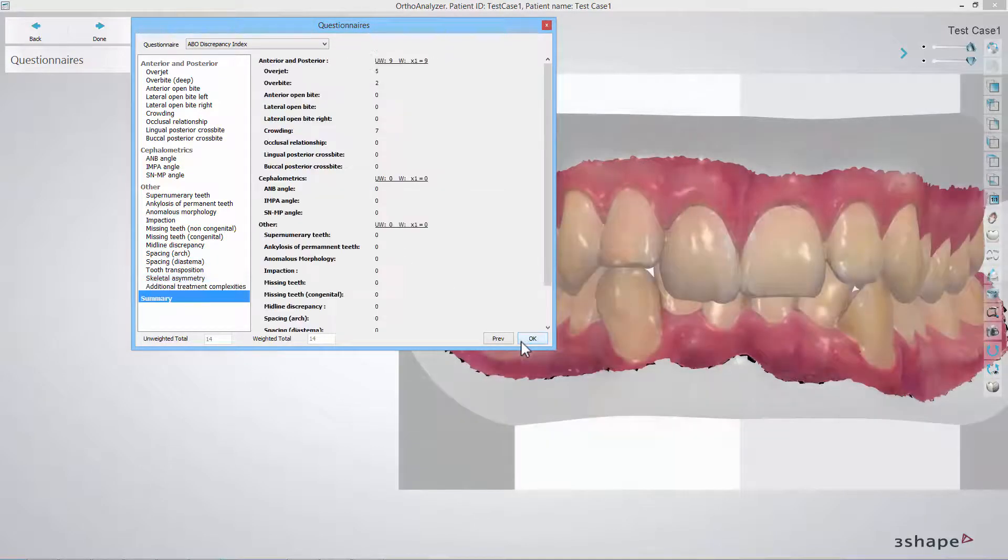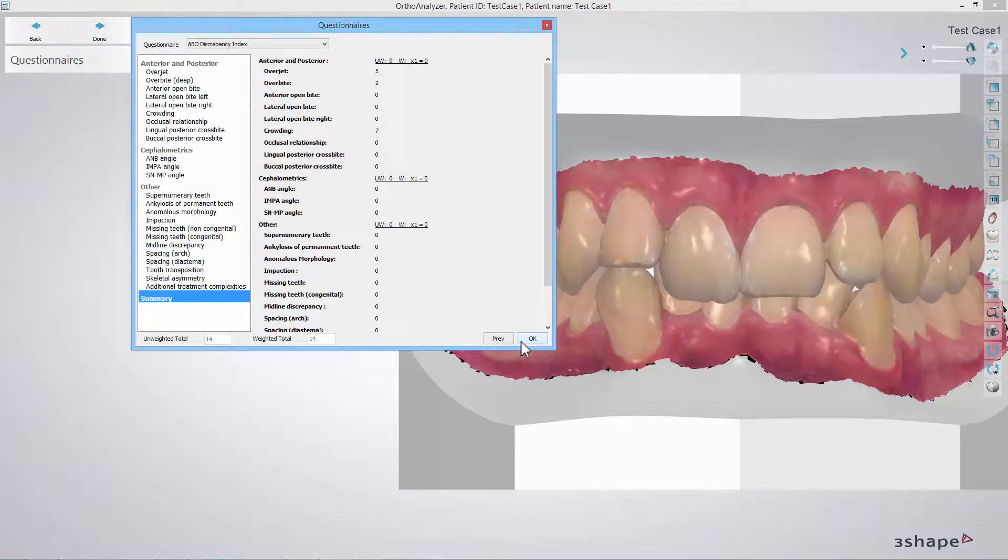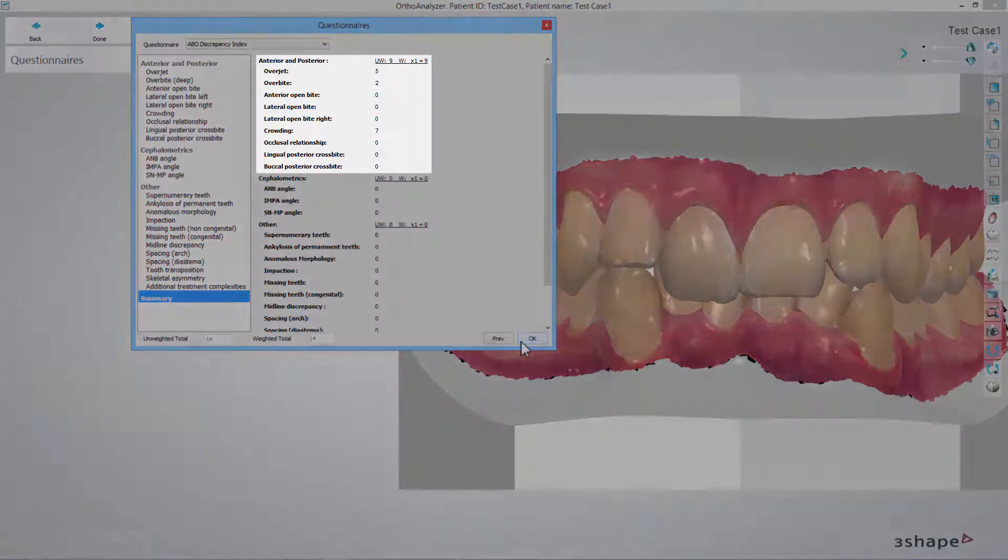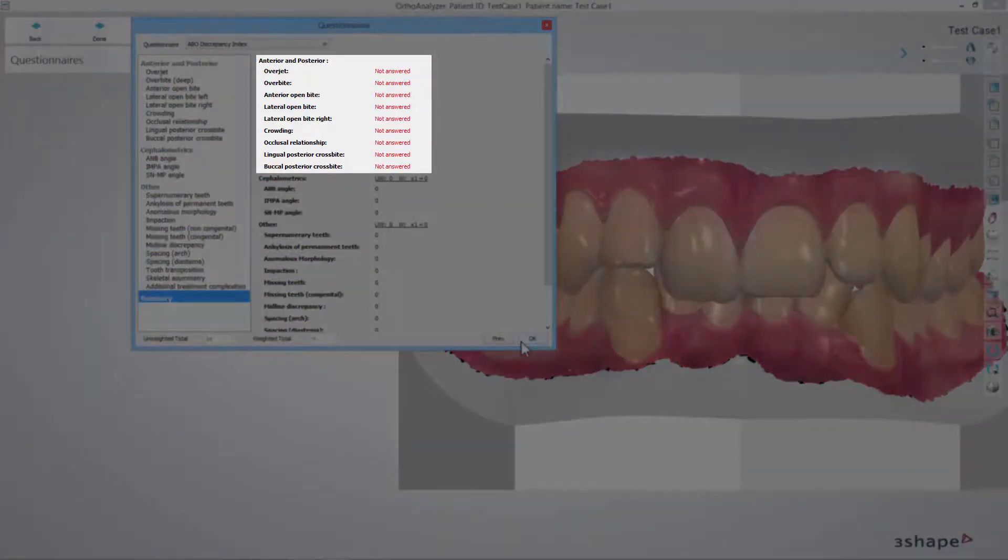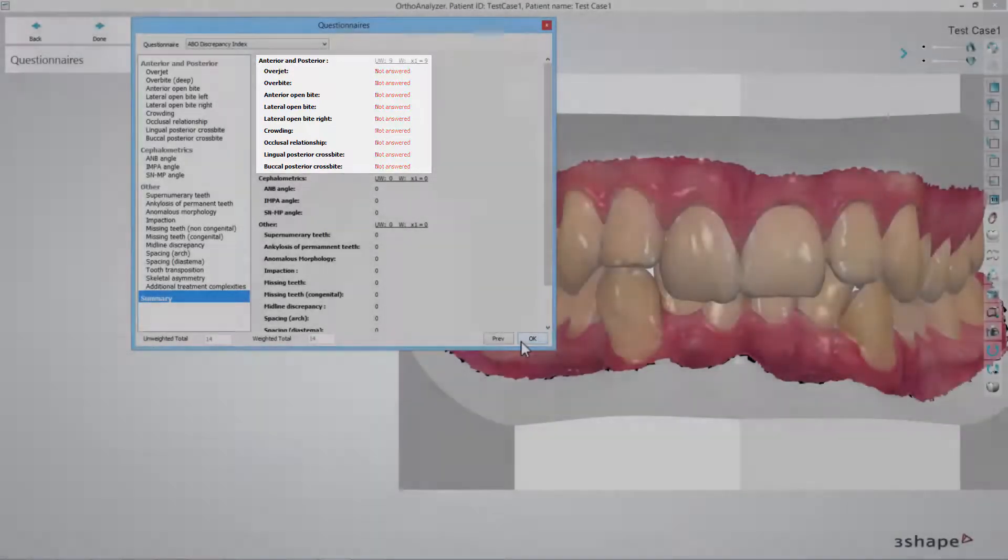At the end of the analysis process you will see the summary. It consists of all the steps involved in the ABO scoring. Any unanswered steps will be correspondingly marked in red, so you can go back to them and complete if needed.